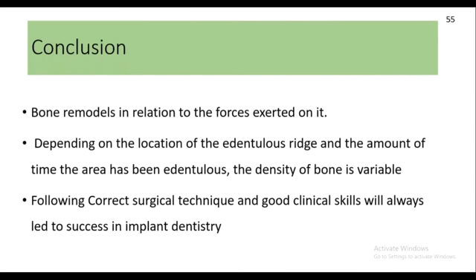So to conclude, bone remodeling is related to the force exerted on it. Depending upon the location of the edentulous area and the amount of time the area has been edentulous, the density of the bone is variable. Following the correct surgical technique and good clinical skills will always lead to success in implant dentistry.